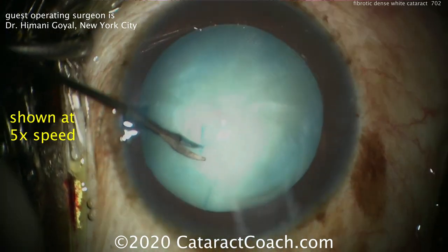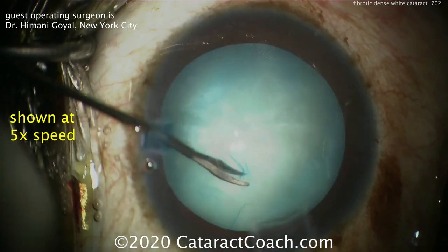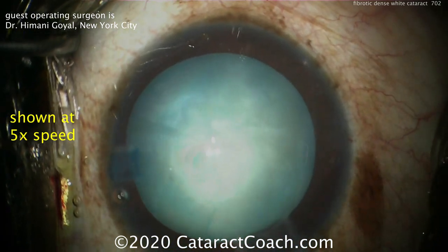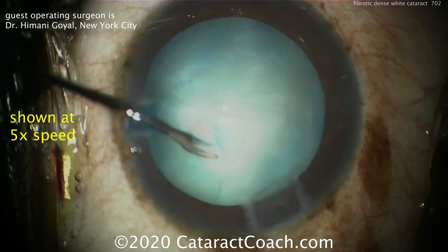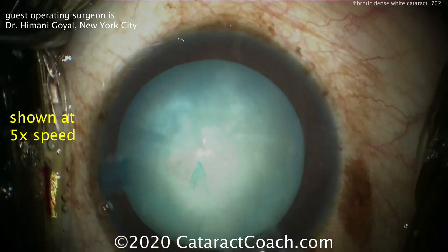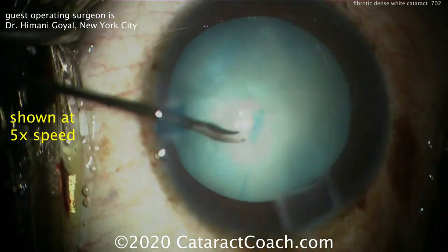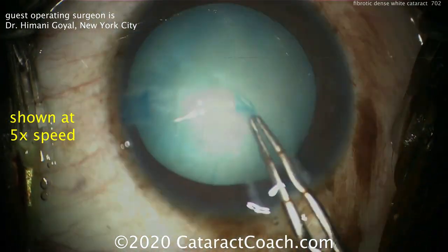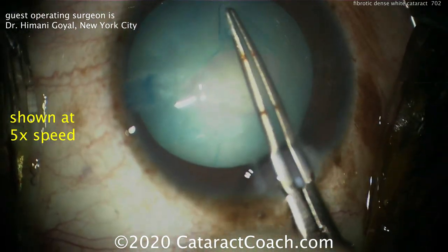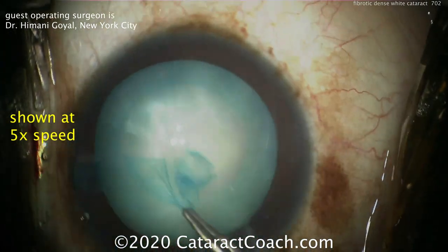There's some fibrotic material that's holding the anterior lens capsule to the calcified cortex. So now Dr. Goyal is going to use 25 gauge or 23 gauge retinal scissors through the paracentesis to make a small incision there at the point where it's stuck. By doing this, she's able to continue the capsulorrhexis and move around in a circular fashion. Notice the way that the curve of the retinal forceps is aligned with the curve of the rexis.